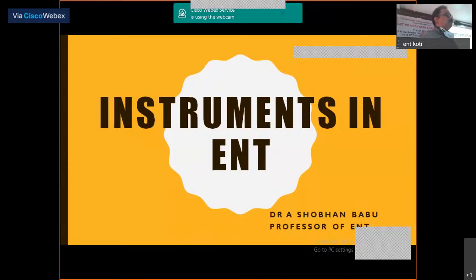It would help you in scoring better marks after you are doing this. Okay, so I project the instrument. I request people to answer not in a group, but one by one. On this side we start, and you can tell me the instrument. So, shall we start?